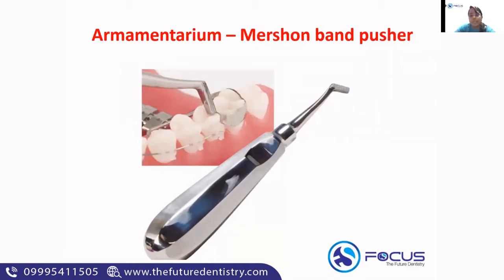So keep the image in mind. This is the picture of a band pusher. Okay, this is a Mershon band pusher.